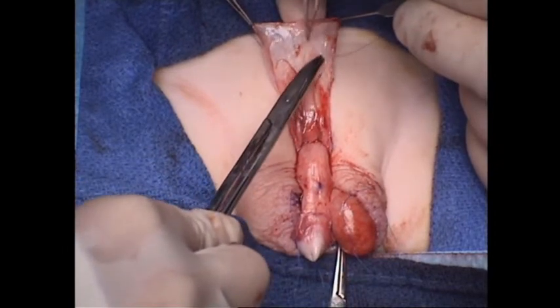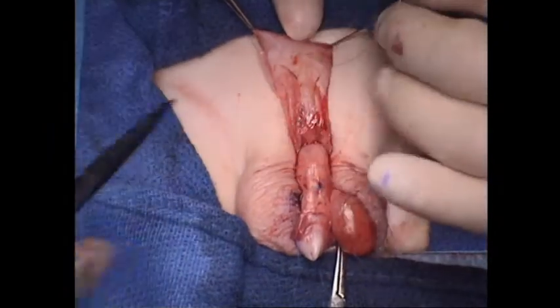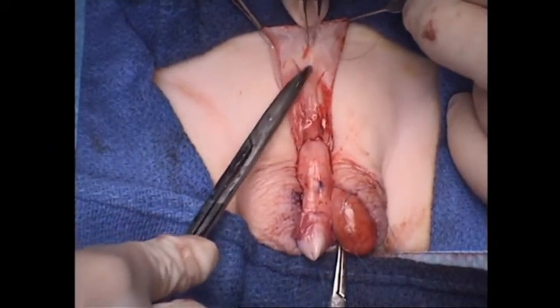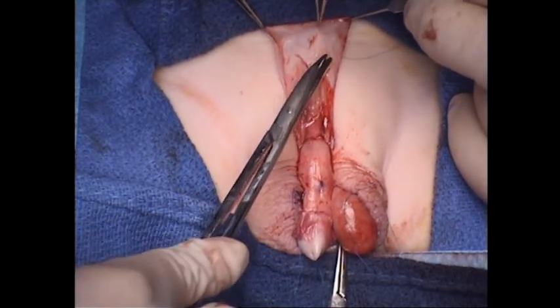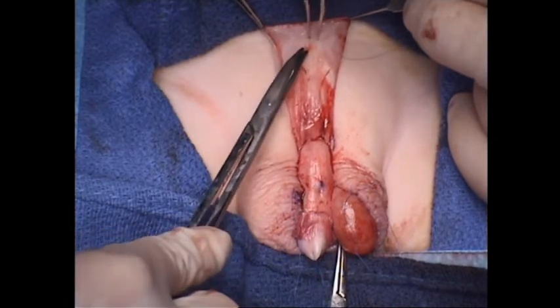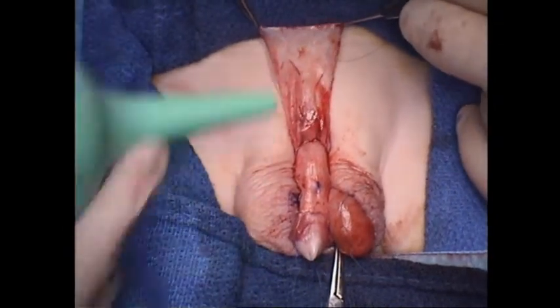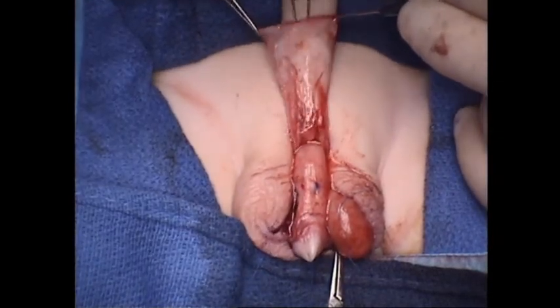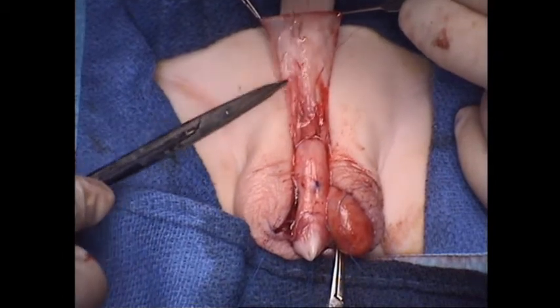Look how big this is all becoming. And we haven't even taken this part off down proximally. If we needed a longer graft, we could take all that off. It helps to periodically wet your graft, just so those tissues don't get dry.